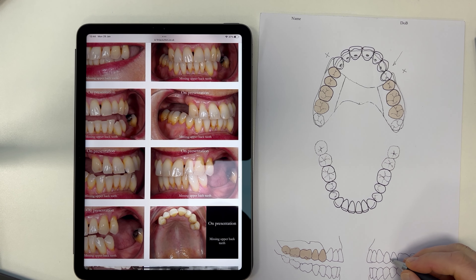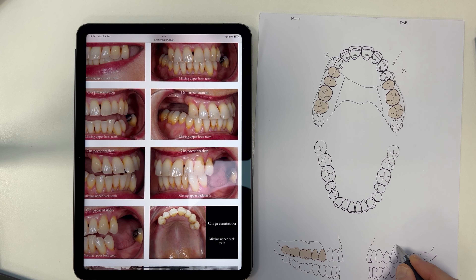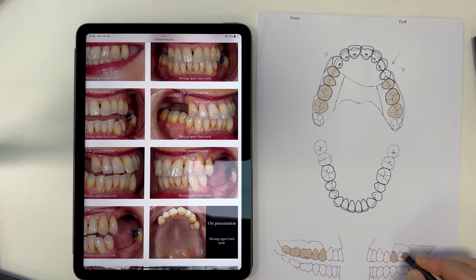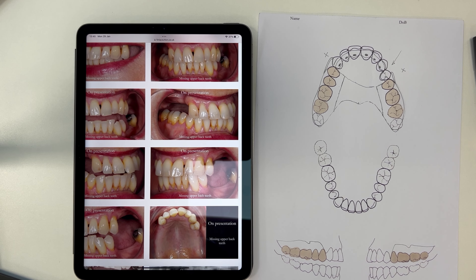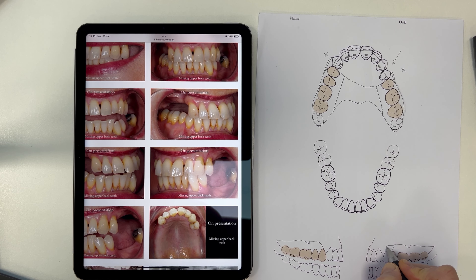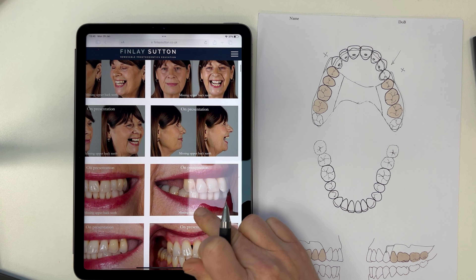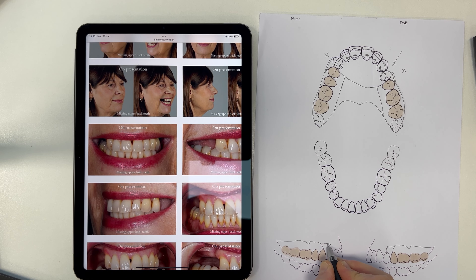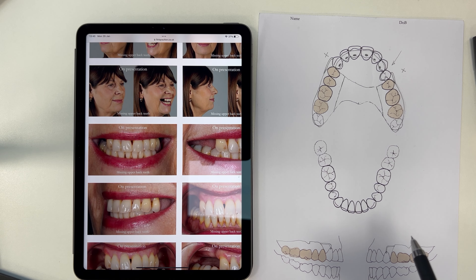So we have one, two, three, four and then it goes to there — that's the design further back. These are the missing teeth on there just like that. I'm going to draw on where the clasp is going to be, so we want the eye bar to come really high like that so it's covered by the smile. Same on this side — really high. And then down — if this was really visible I'd be looking to potentially just do a shell clasp on that.